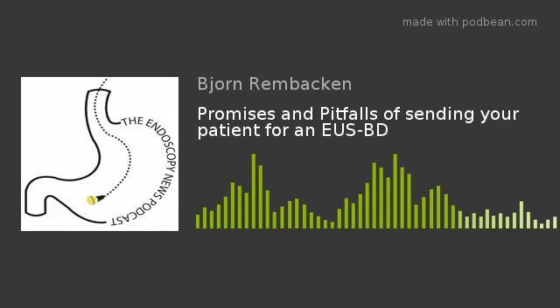At the time of the procedure, you have a very good understanding as to whether the stent is in the right place. You have a very good understanding as to whether there is significant pneumoperitoneum, and afterwards, the chance of the stent then spontaneously falling out is pretty unlikely. So generally, we would know around the time of the procedure, but we have to be very careful because people who have less experience in these procedures may not understand that, and it may lead to unnecessary interventions.